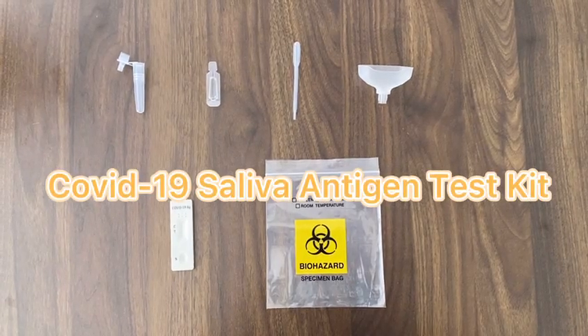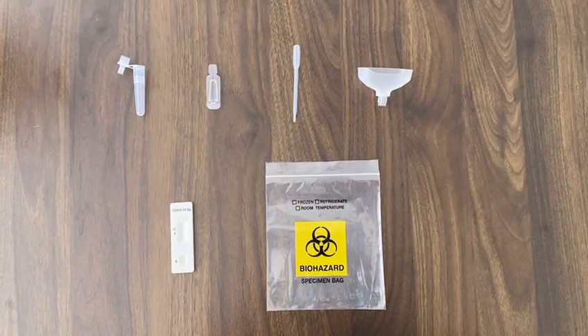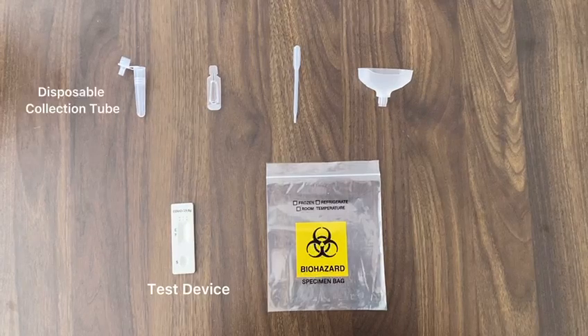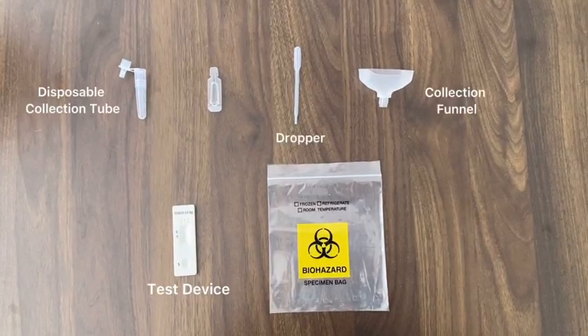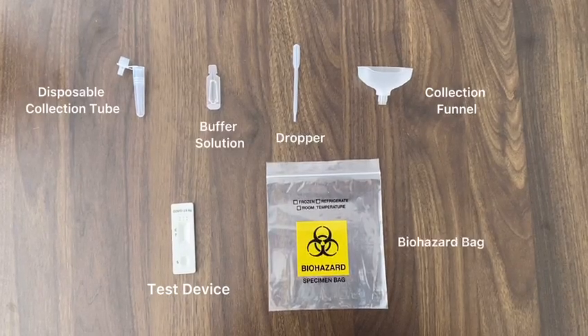This is the COVID-19 saliva antigen test kit. One set of test kit consists of a test device, disposable collection tube, collection funnel, dropper, buffer solution, and a biohazard bag.